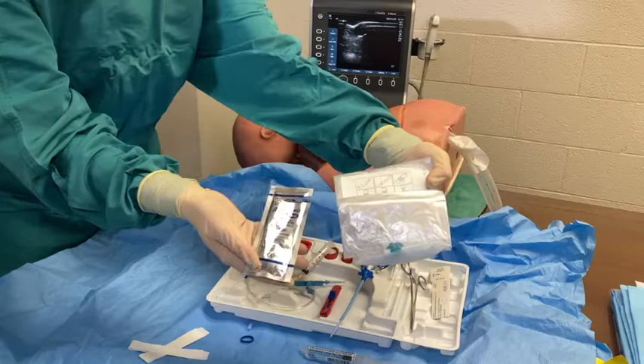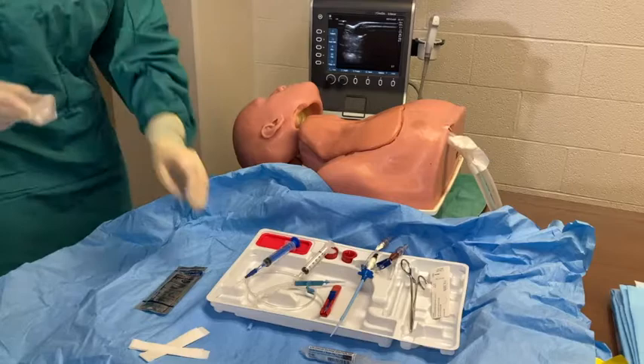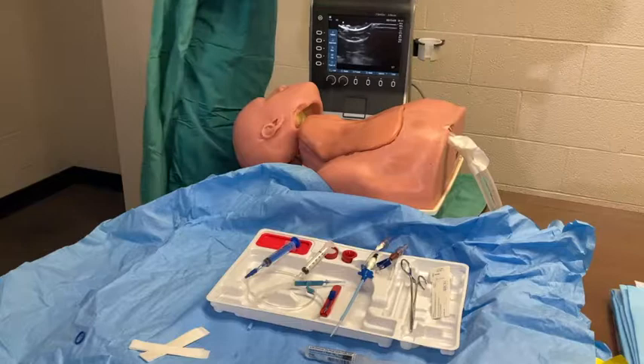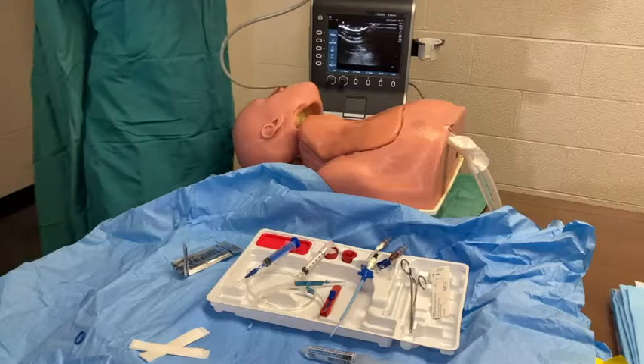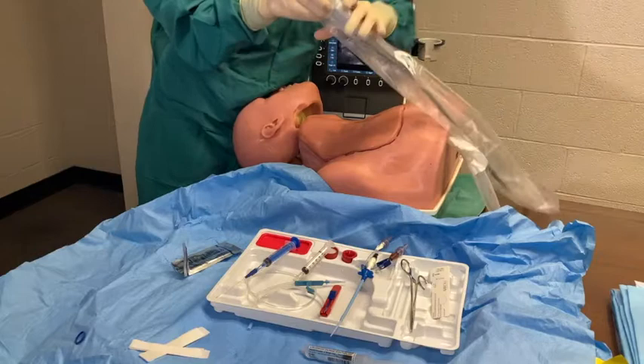Once the kit is set up, you will place a sterile drape cover over the ultrasound probe. Be careful not to contaminate yourself during this step and ask for help as needed. Slide the probe cover down the ultrasound probe and tail of the probe.